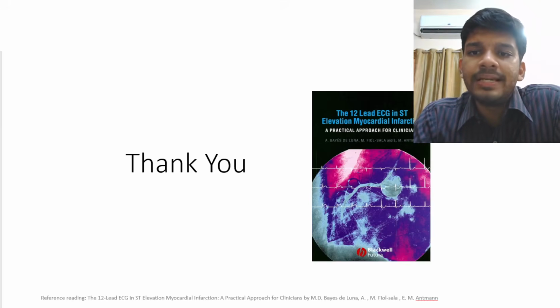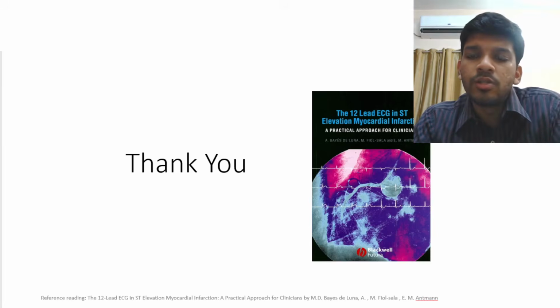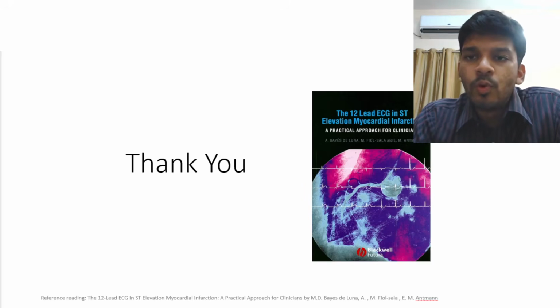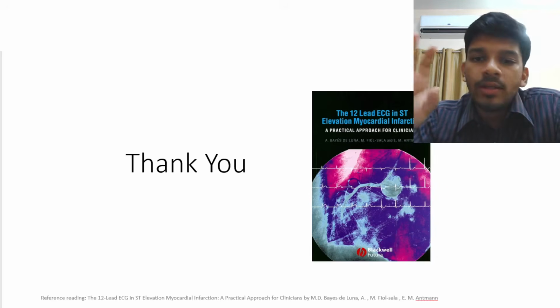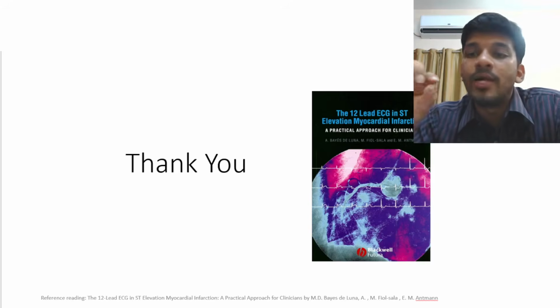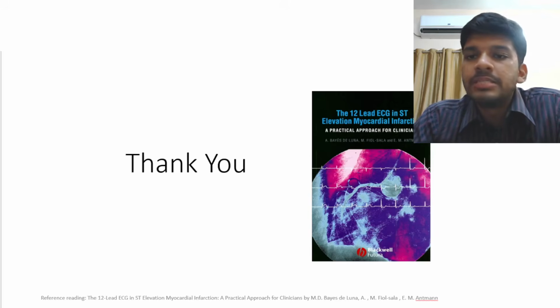This is the 12-lead ECG in ST elevation myocardial infarction, and its authors are Bayes de Luna, the main author for this book, and other contributors are Fiol, the cardiologist who gave the Fiol algorithm, and Antman. So these are the three authors of this book. It's a beautiful book, and gives other images regarding how the injured myocardium will look on the echo, and what segments of the left ventricle will have LV dysfunction, segments 1 to 17, and how we map them. This was the source for most of the ECGs and most of the injury vector images. I would like to really thank the authors for coming up with such a book.